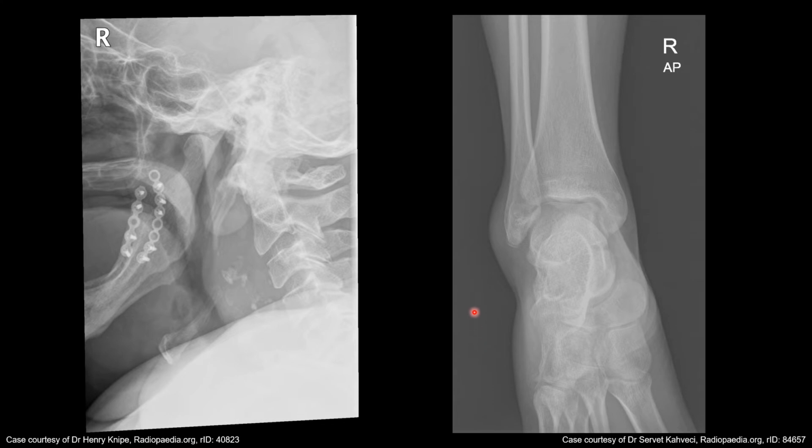On this right image, we're looking for any kind of soft tissue abnormalities, and if you notice here, there's some swelling, and if you look really close, there is a sliver of bone at the distal tip of the lateral malleolus. So there was an avulsion fracture there that led to that swelling. You might not always have that avulsion fracture, you might just see the swelling, but that's why it's important to pay attention to the soft tissues.